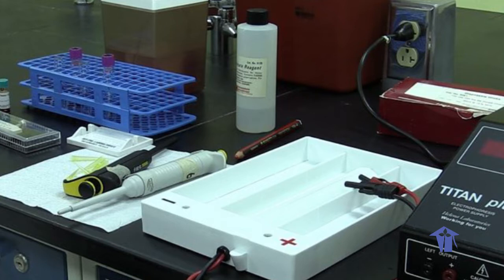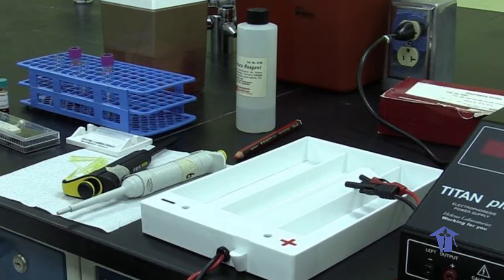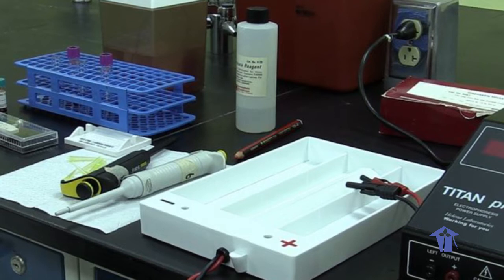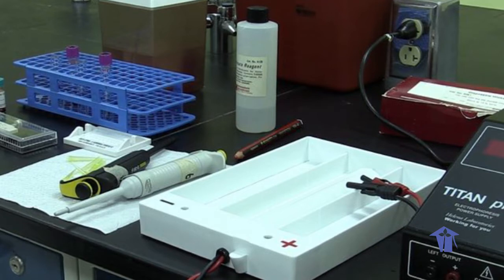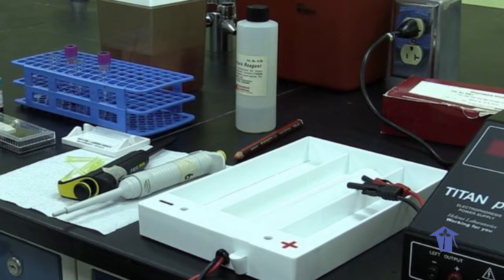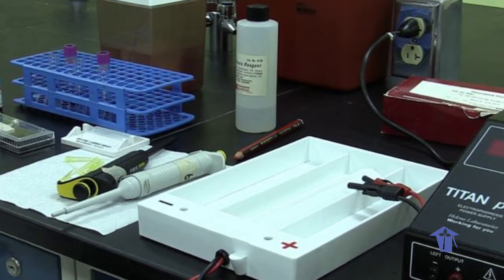Then there are some hemoglobin variants in which the amino acid substitution is internal, not external, and therefore they may not separate from the other hemoglobins. Those that have an amino acid substitution that has no effect on the overall charge will not separate by electrophoresis.